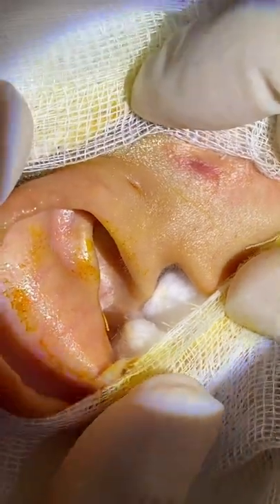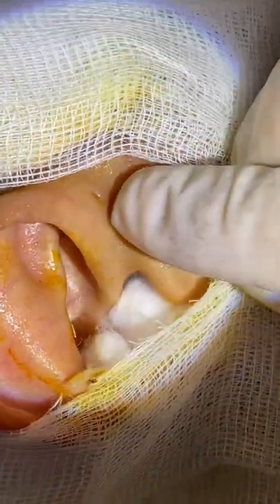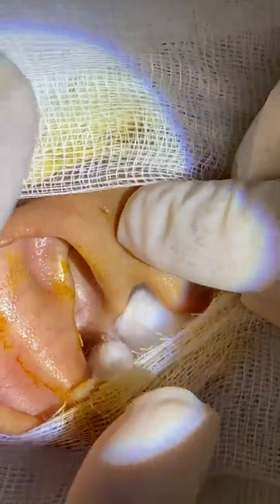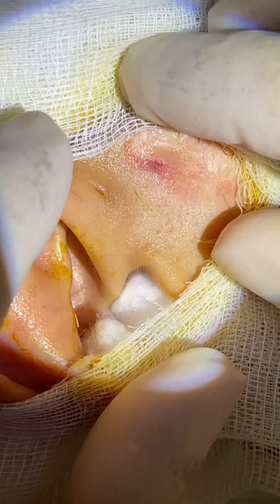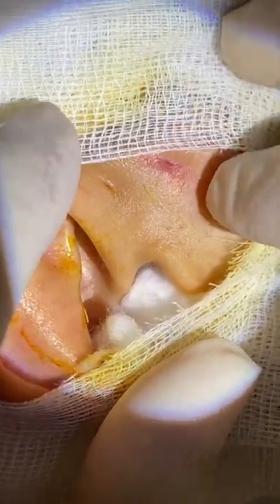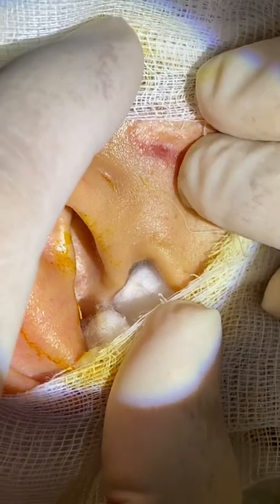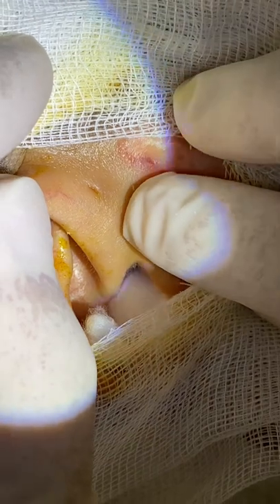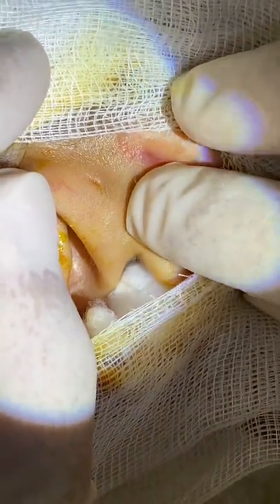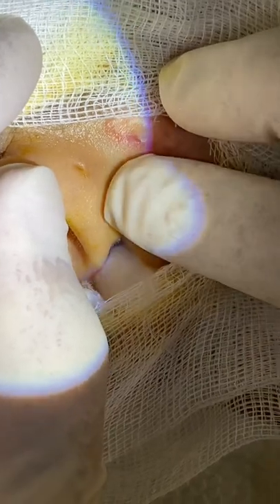We will sterilize the field, and this is the preauricular sinus that we are going to remove. This patient had an infection already, and there used to be pus coming out from this area. We have to remove the sinus now because the infection will become recurrent if we don't.